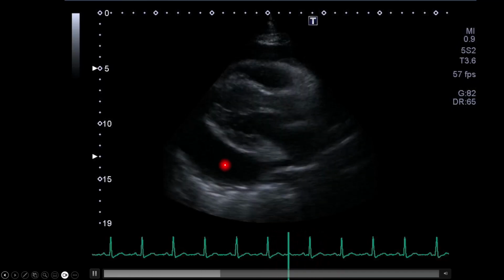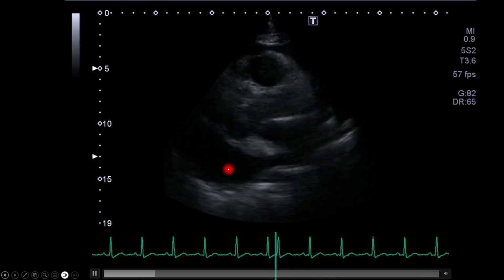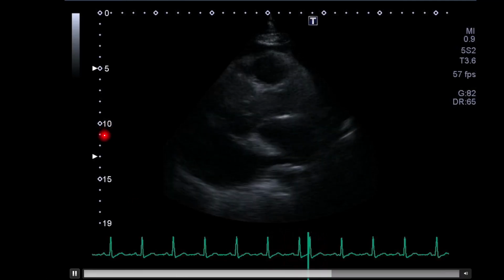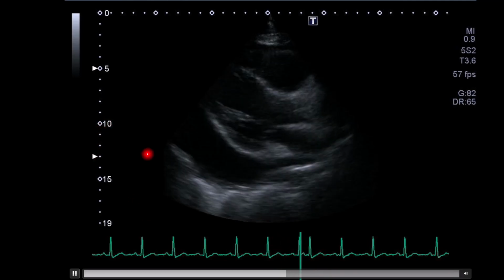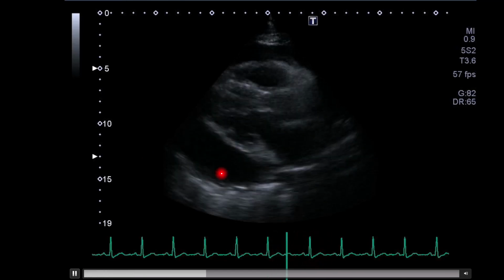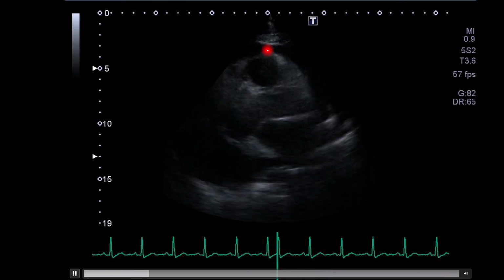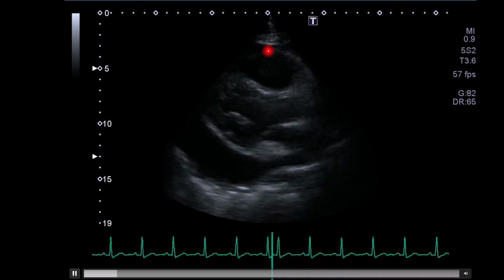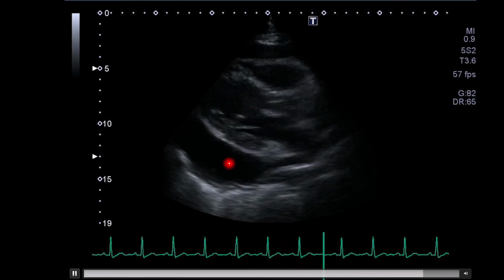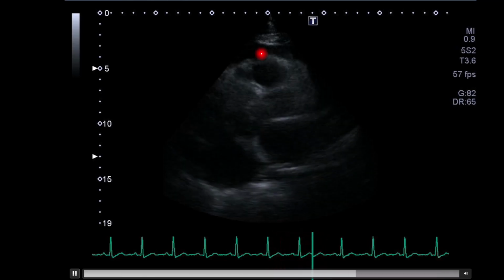And I think what is immediately apparent is a large pericardial effusion that extends posteriorly, especially behind the posterior wall. If we look at the scale over here, the extent of the pericardial effusion is perhaps 3 centimeters. And here, too, above the RVOT, we see a pericardial effusion located anteriorly. Here it is significantly smaller than posteriorly, perhaps a maximum of 1 centimeter in diastole.